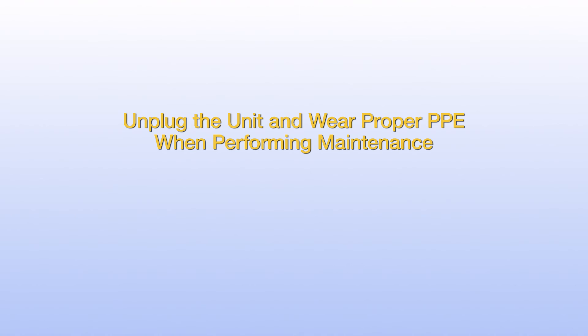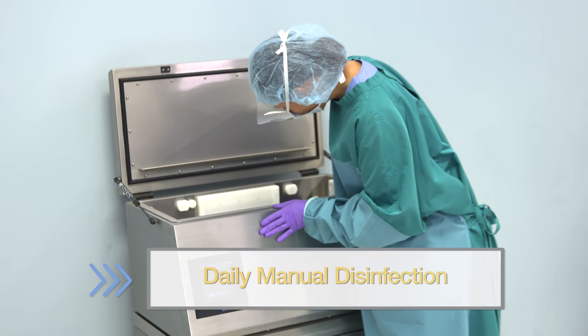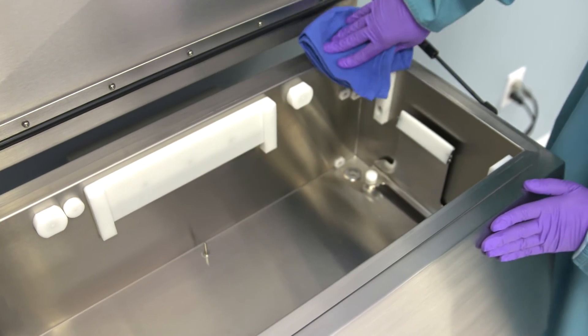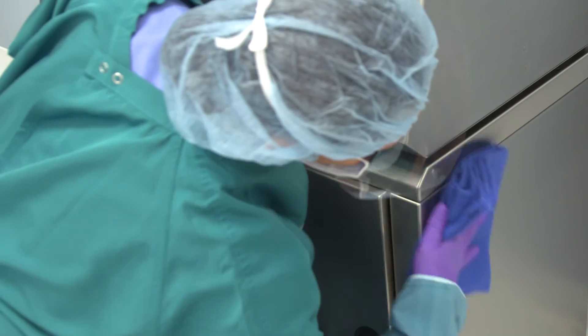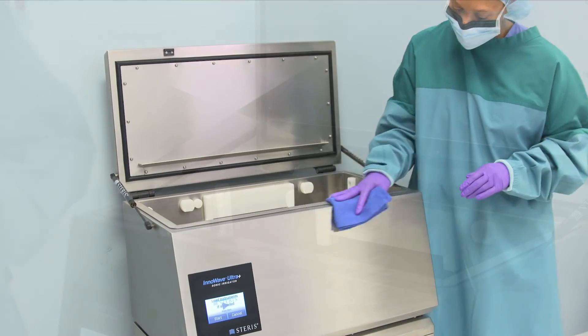To keep your ultrasonic in excellent condition, clean and maintain it regularly. Remember to disconnect power from the unit and wear proper PPE when performing maintenance. Follow all facility procedures and refer to the user manual for full maintenance information. Daily, spray and wipe down all internal surfaces above the water line using a disinfectant and a clean cloth or paper towel, including the inside of the lid and around the seals. Wipe all external surfaces, including around the sides of the doors. Remove any trace of cleaner from internal and external surfaces with a clean, wet cloth, and then towel dry.